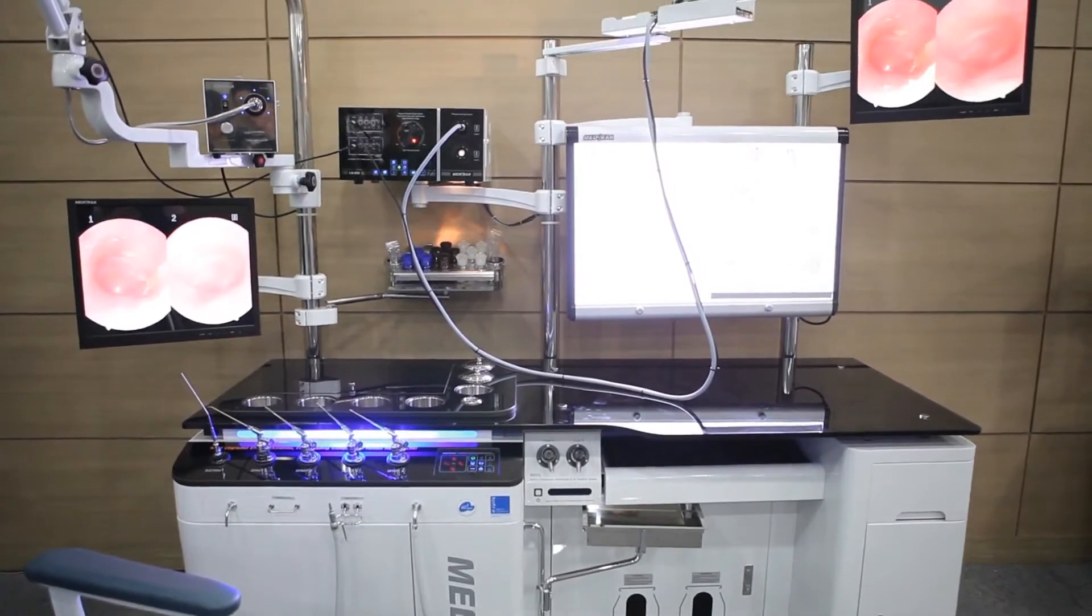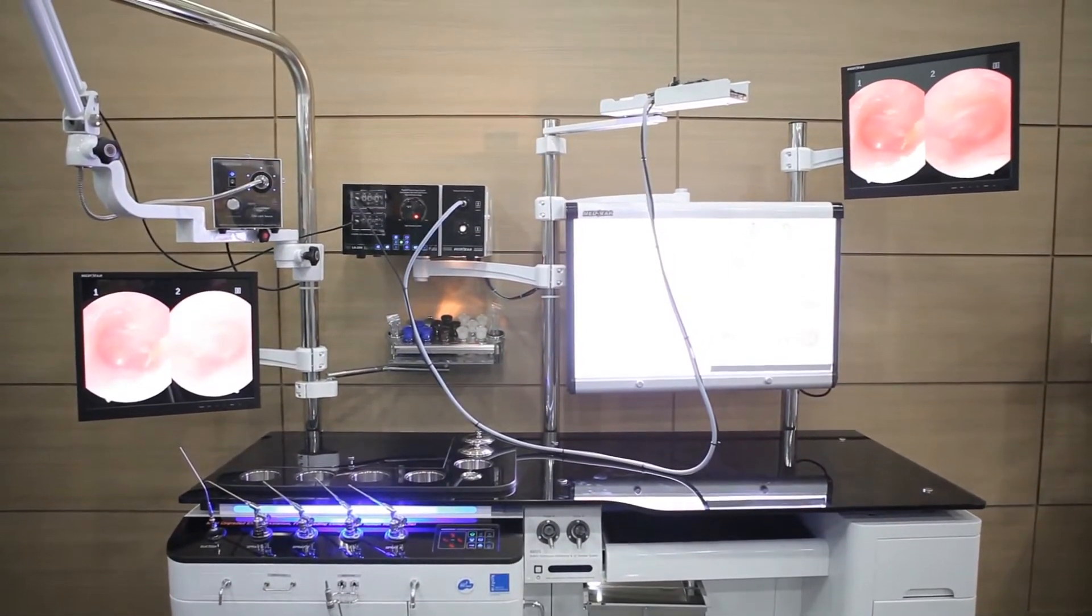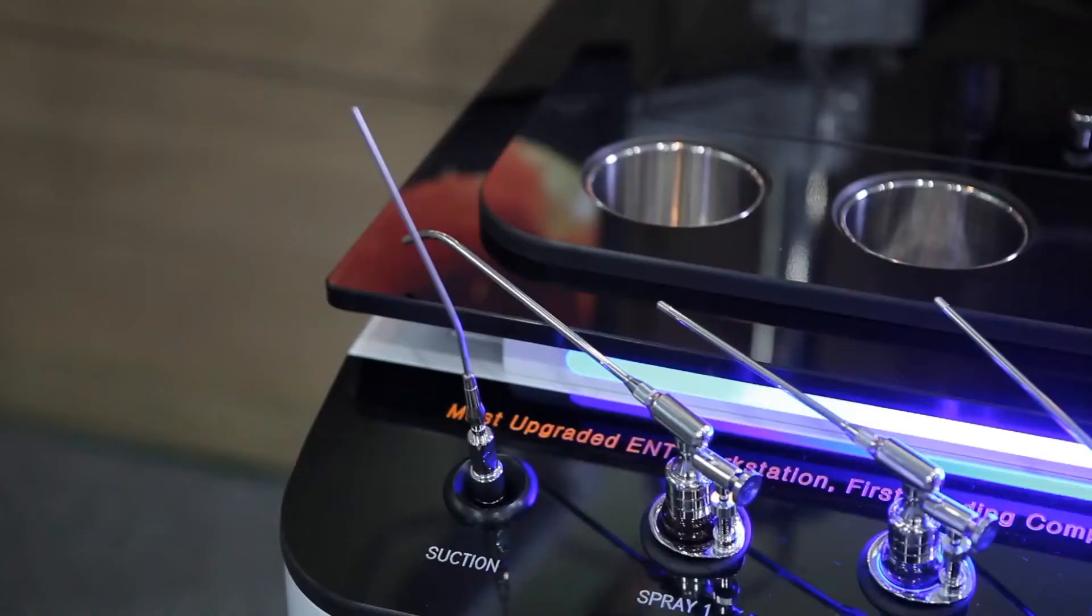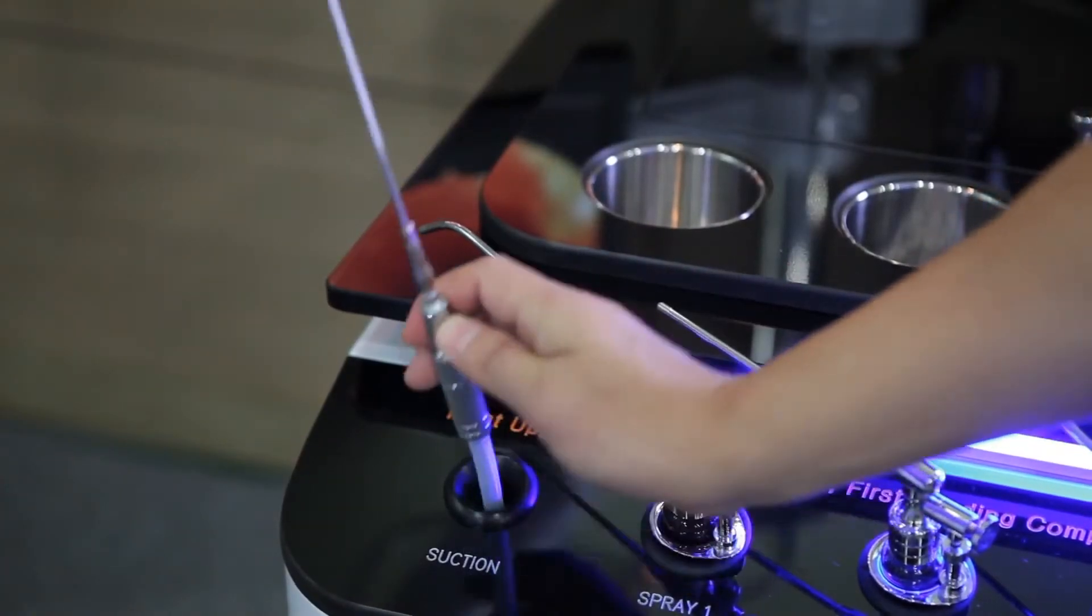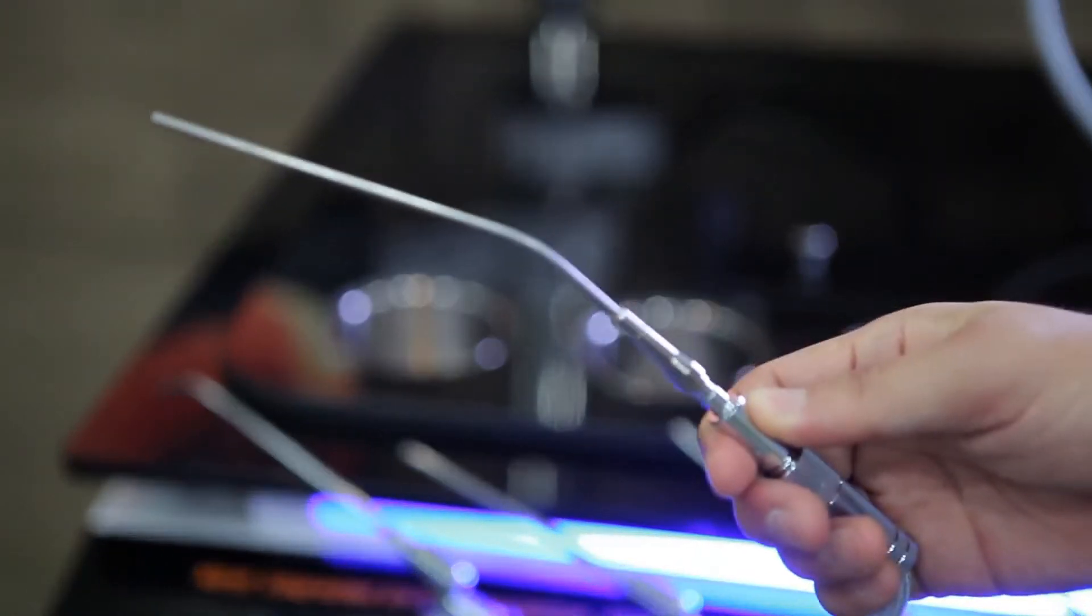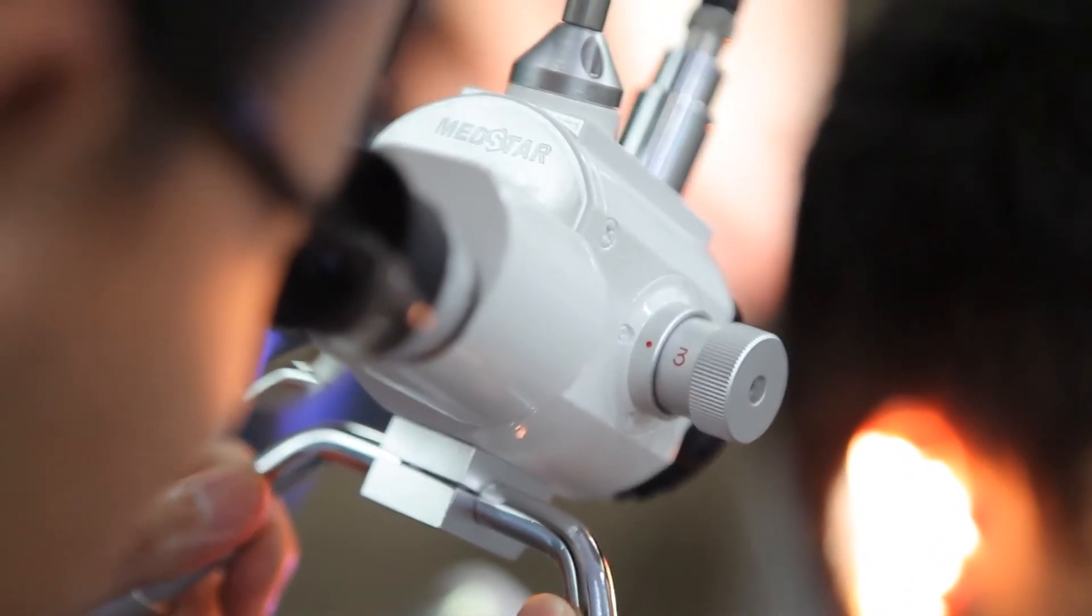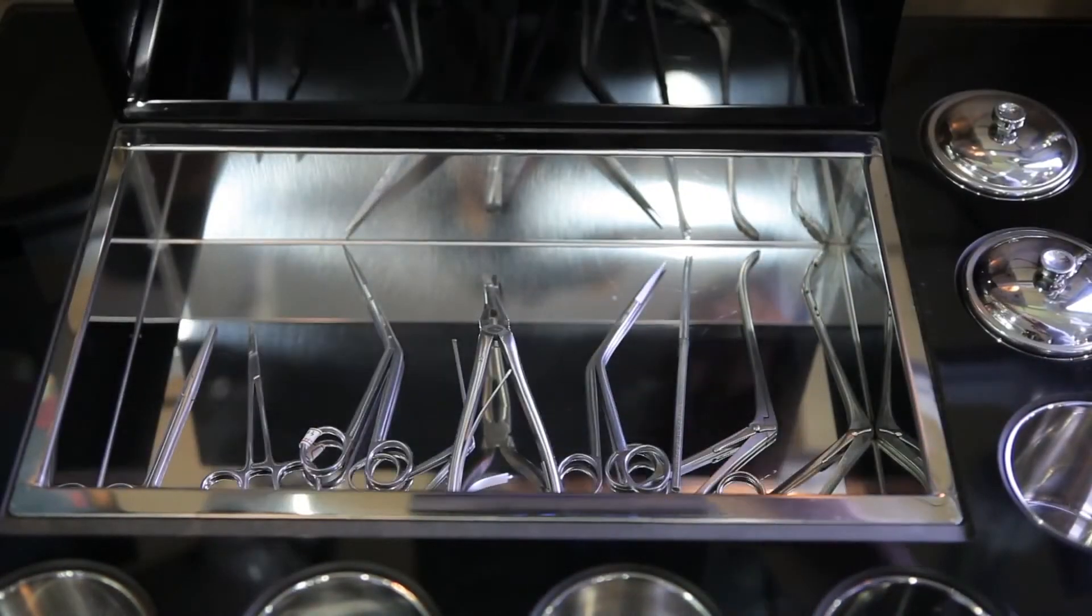This is medical equipment used for treating patients with ear, nose, and throat diseases. It consists of a spray system for treating patients, a suction device to remove foreign substances in a patient's nose, an endoscopic light source that allows the doctor to look inside a patient, and a device holder for displaying and storing various devices.